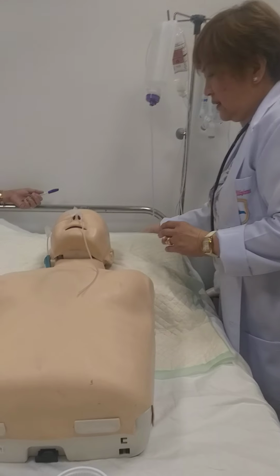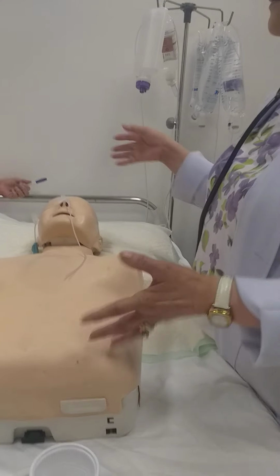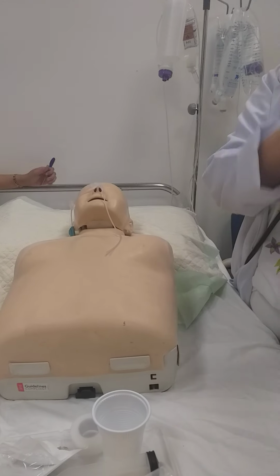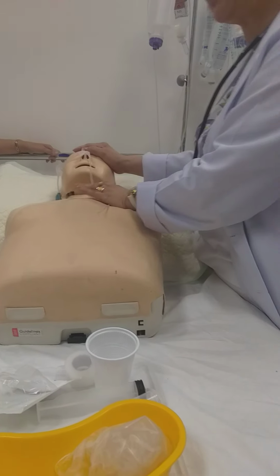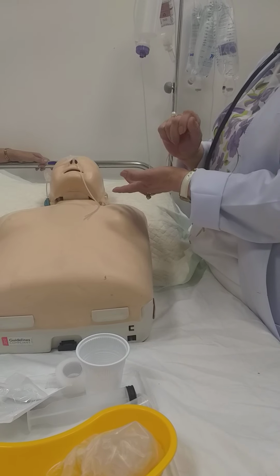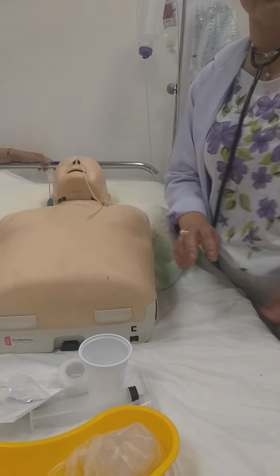Okay? So now, again, if we have our gloves, hand hygiene, and go back to the patient, keep the patient comfortable, and document. Okay? So that's all for our NGT feeding.